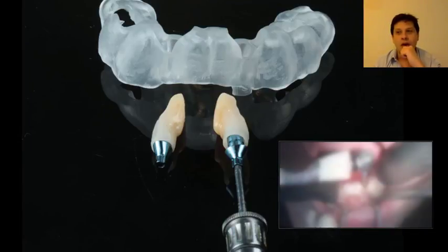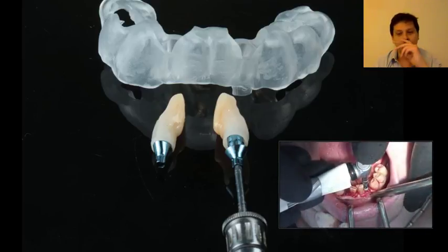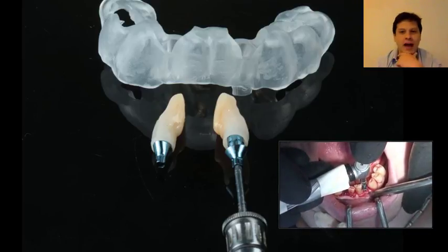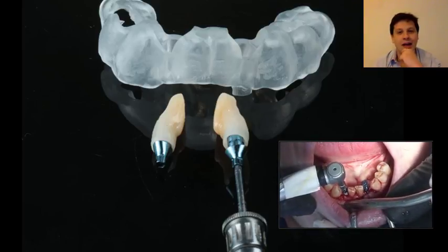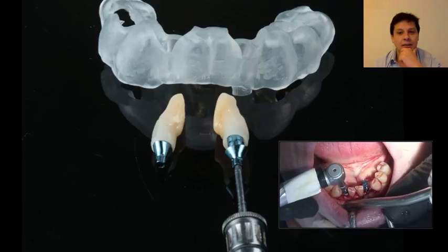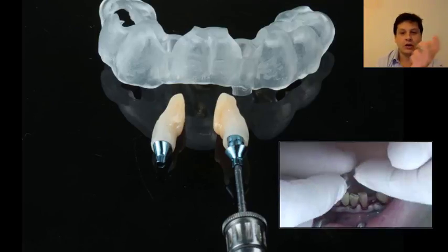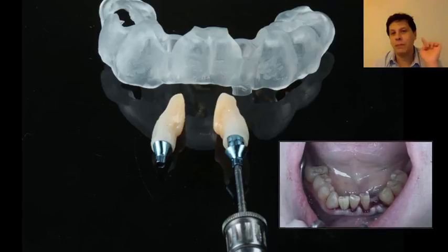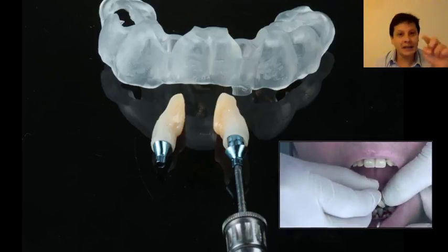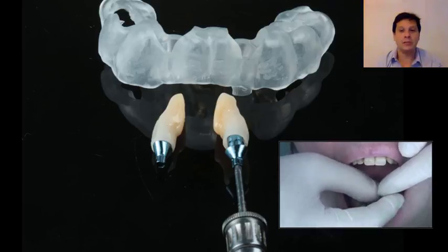Now, we are ready to go for immediate loading with non-occlusal contact, because we knew that we were going to have high primary stability. So looking at the lower right corner, you see that implant placement is now guided through the first drill that you did according to your surgical guide. And because everything was ready from the beginning, this is a case where we planned the surgery and we planned the provisional restoration. And so we went in, placed the implants, and placed the provisional restoration.